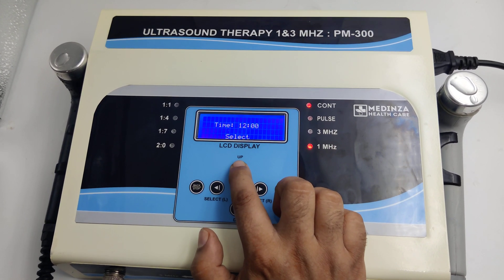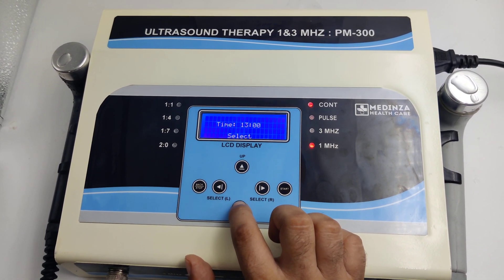Set the timer — you can increase the timer up or decrease the timer down as per your need.